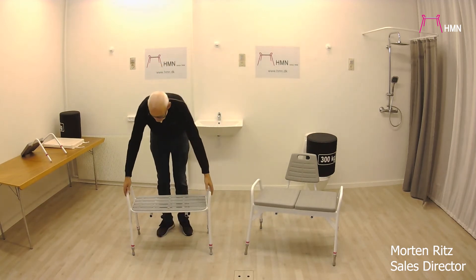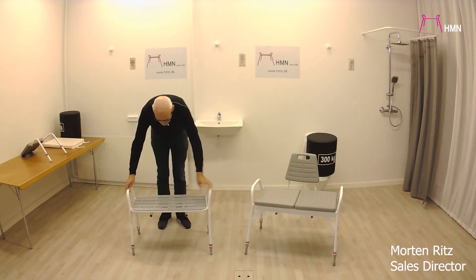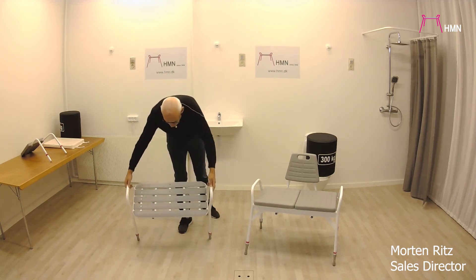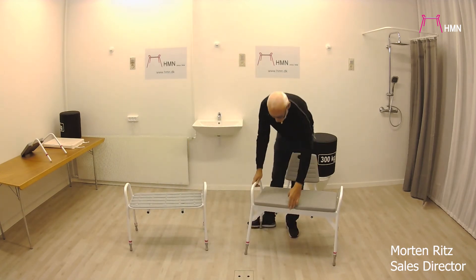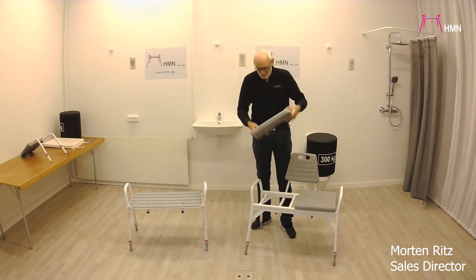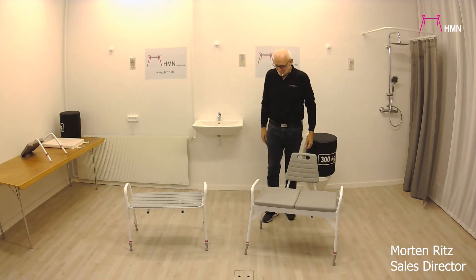This one is called the 200, and as you can see the seat is different. It is made so it's easy to clean and water can easily escape from it. The other one actually uses seats from our Neptune Super Soft — two of them fit in here, so you will be able to use them.